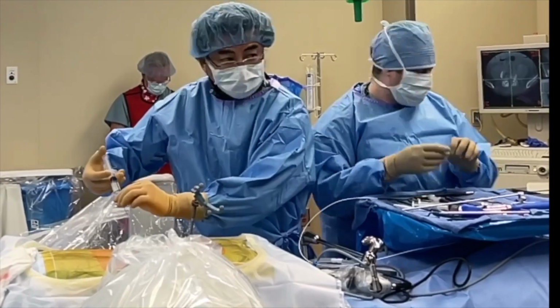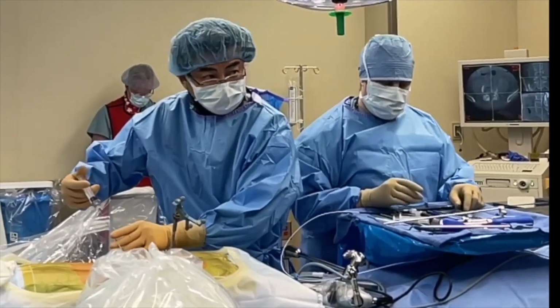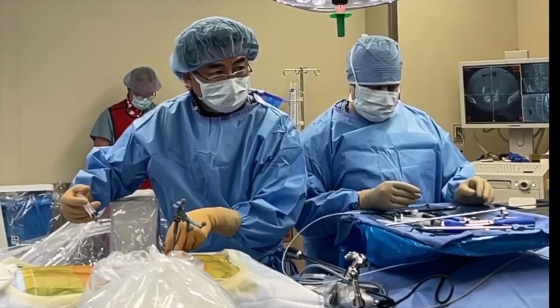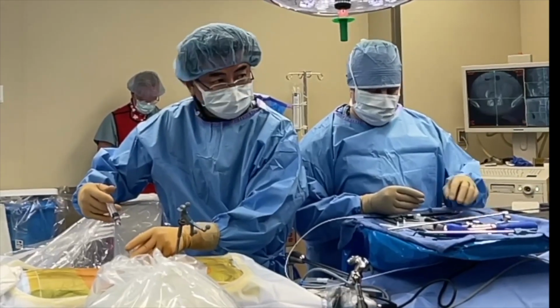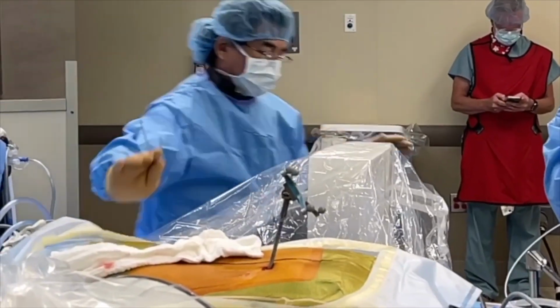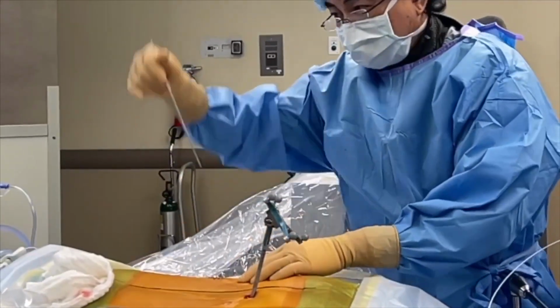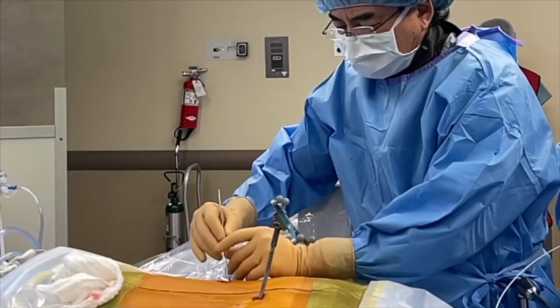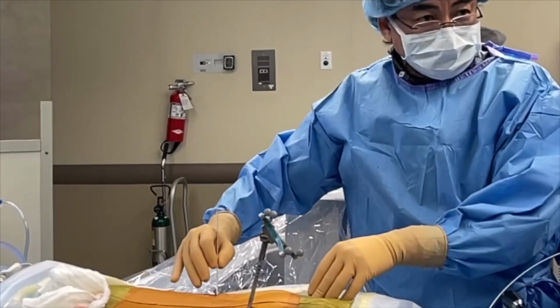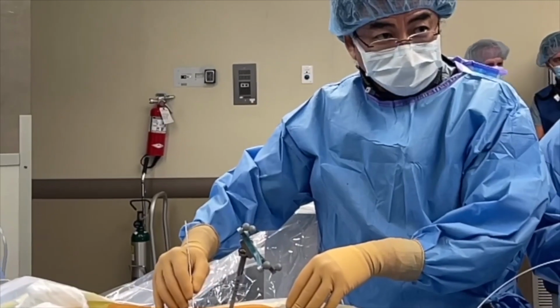Anesthetizing the surgical corridor before I make the incision, because that's the gentle millennial way. Be nice. Shot. Be sweet. Your back is crooked. Look at the angle of the C-arm. It's crazy. Just the way we like it. Spaghetti noodle dilator. Delicate Asian fingers. Pinky out. Shot. Shot. Get the guide wire.